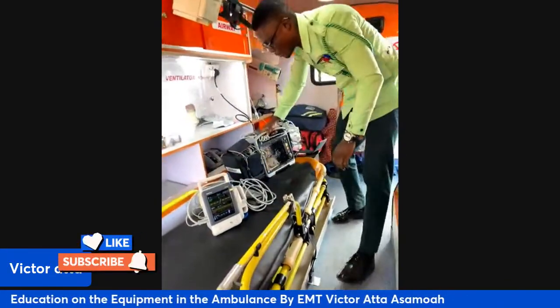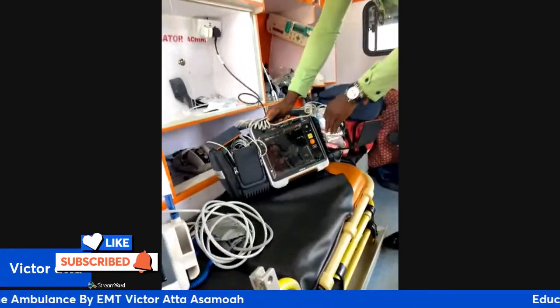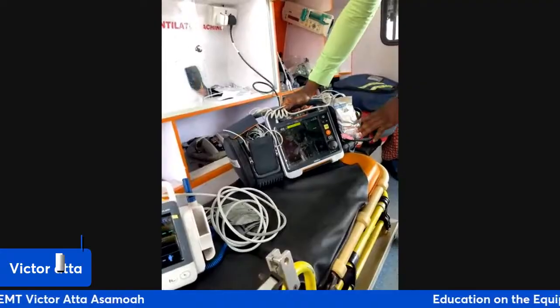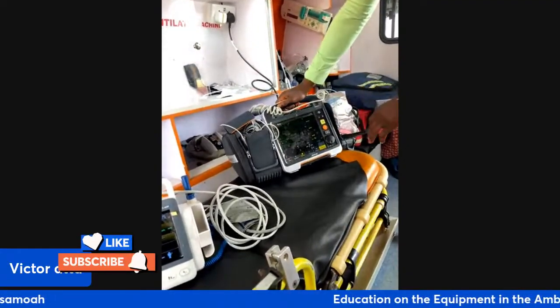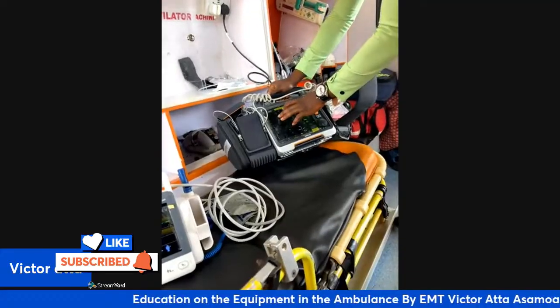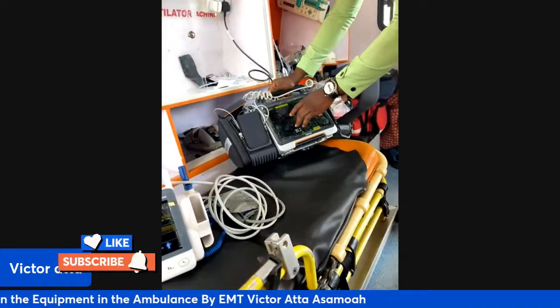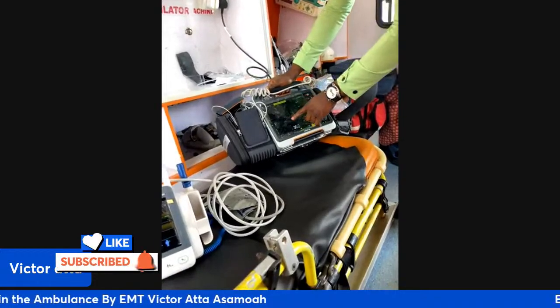Whilst the advanced monitor, let me turn it on. This advanced monitor allows you to see the CO2, that's the carbon dioxide. It allows you to know the respiratory rate.